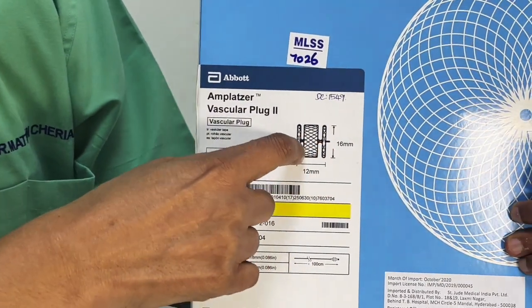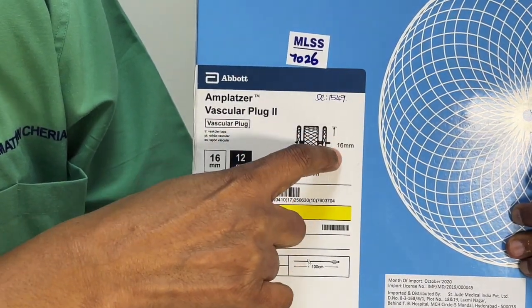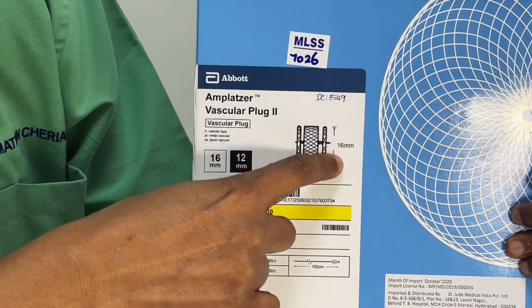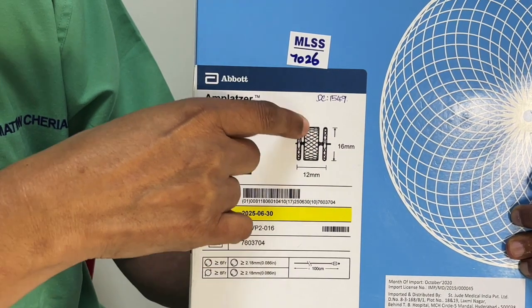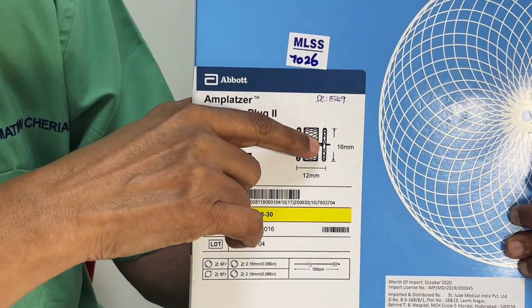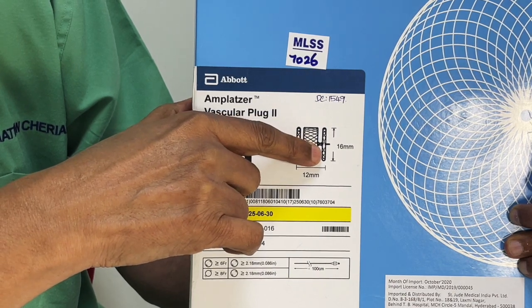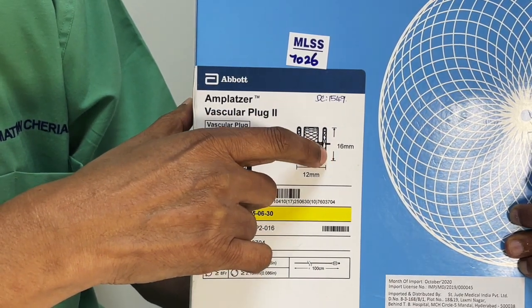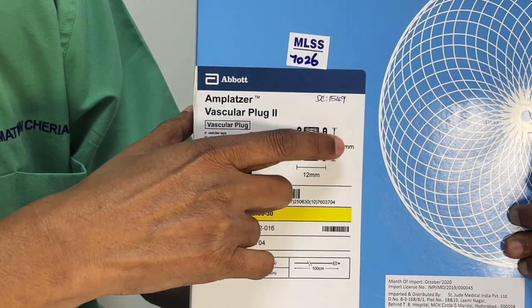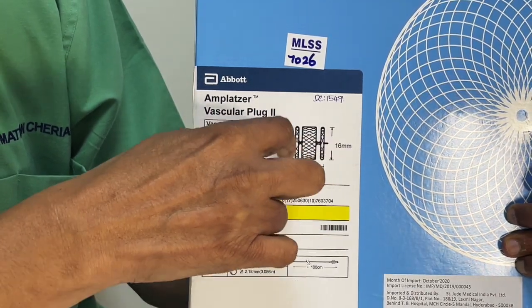So this is actually the picture of the Amplatzer plug. It's 16 into 12. Don't be too bothered about this 12, but look more at the 16. The only difference when you use an Amplatzer plug is you need a 50% oversizing. So technically, this is ideal for a vessel which is somewhere around 10 mm. So 10 plus 5, 15, so 16.